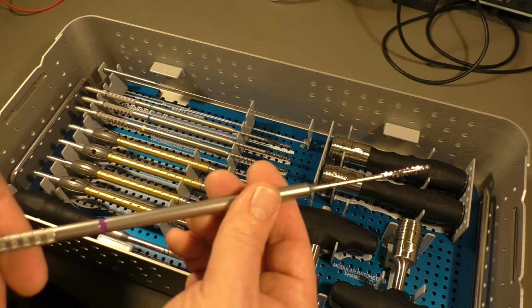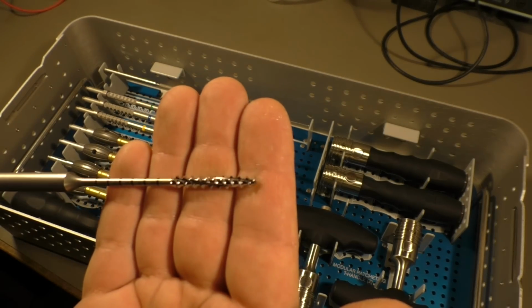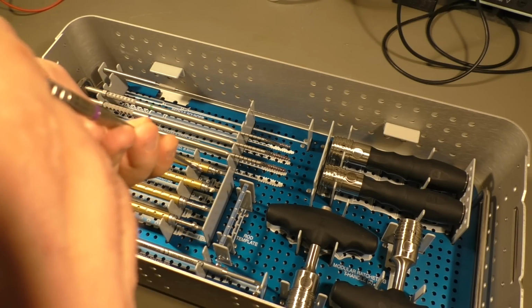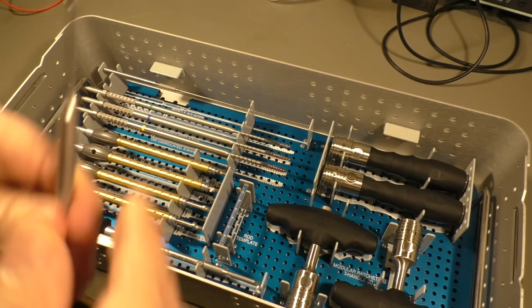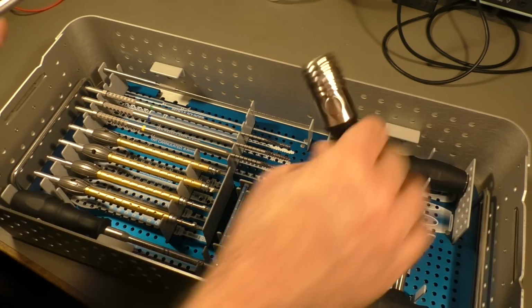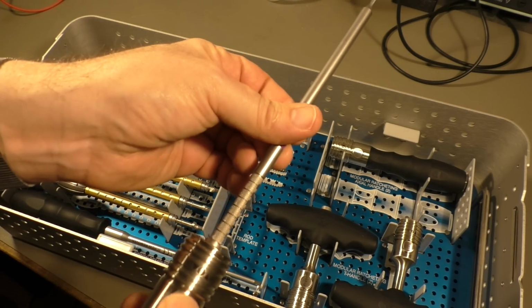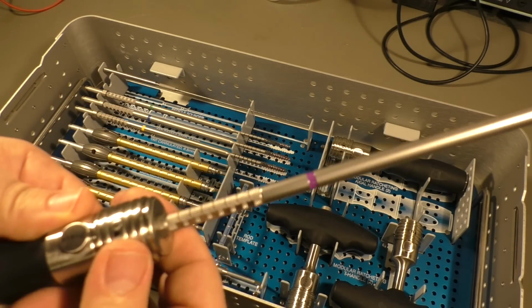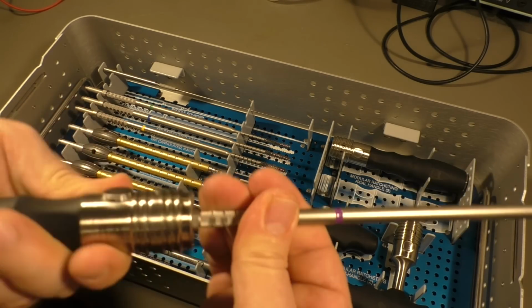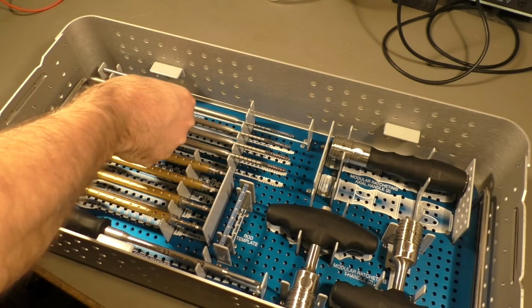There are the tap bits to tap threads into bone for mounting screws and, well, doing some nasty stuff. They are also hollow in the center, so you can probably use them with water to flush, or you use them with this grip here, and that works like so. There is a button to lock it in place, and then you slide that forward and it ratchets to one side, and you slide it back and it ratchets to the other side. Okay, release and change that bit.